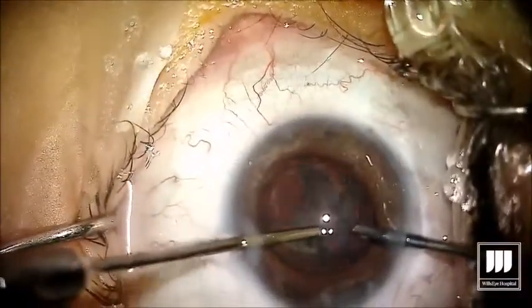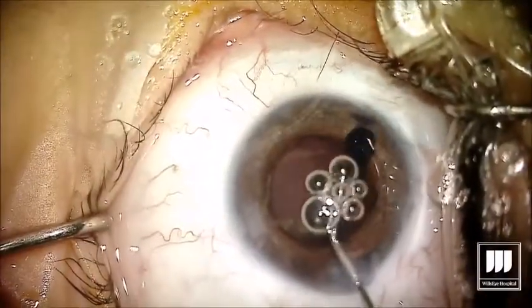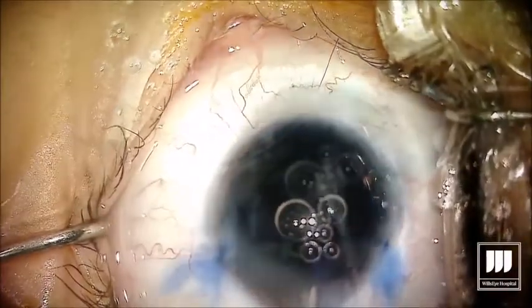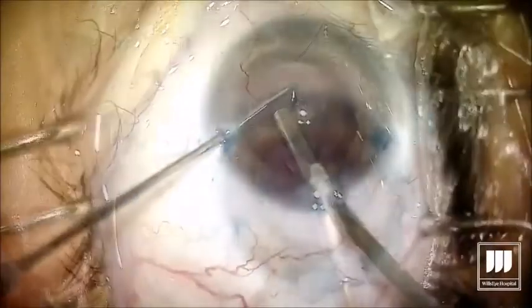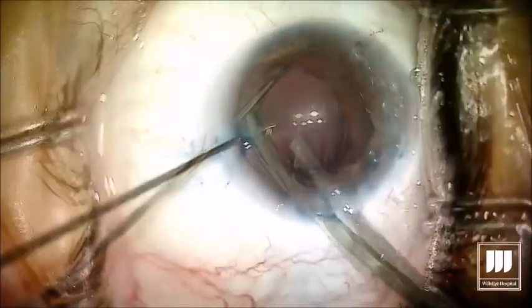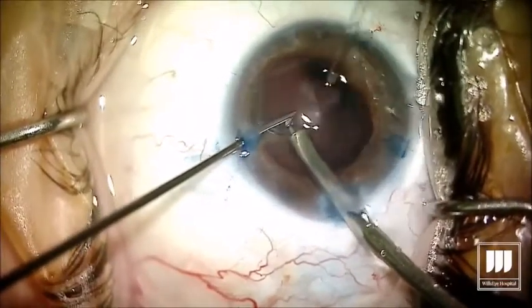The cataract in these cases is quite easy. Now things change a little bit — we're putting trypan blue, or vision blue, in the eye. The cataracts are already gone, and in a few minutes we're going to place our artificial iris. We want to make sure we can see the capsule as the iris is implanted, and my plan for this case is to put the artificial iris in the capsular bag.